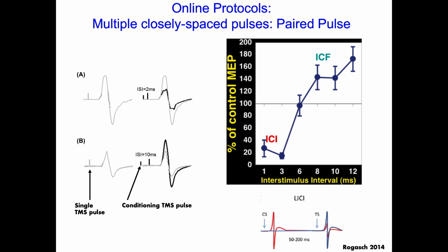And people do also, you don't have to just do pairs, you can actually do, say, 4, or quadrupulse, right? There's even octapulse stimulation. They're essentially very high frequency, right? If there's only 2 milliseconds, that's 500 hertz, right? But they're very closely spaced stimulations or short trains, all right? And those create their own kinds of effects.